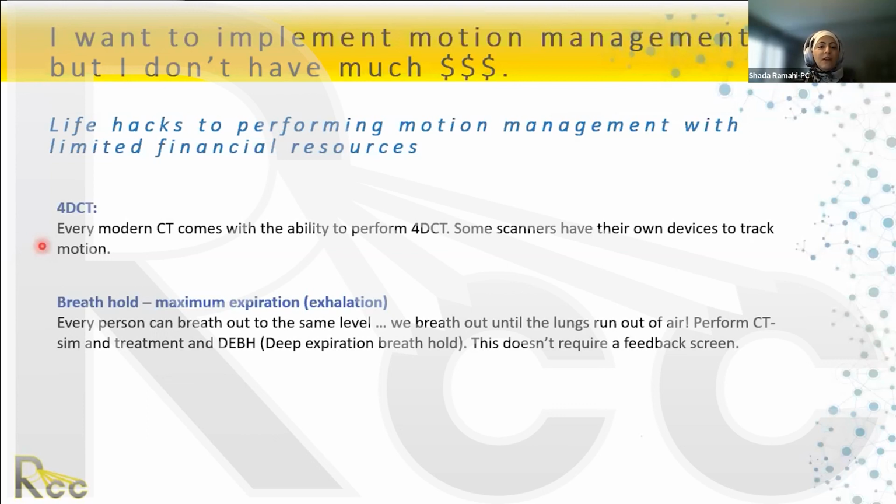If it's more than 5 millimeter, it becomes your own clinical decision, your own clinical protocol. Without spending too much budget, maybe you can create your own breath hold devices. However, if this is something that you do locally, then you cannot connect it to the LINAC for automatic beam on and off. So there's caution to that. But definitely everyone can do an ITV-based technique.